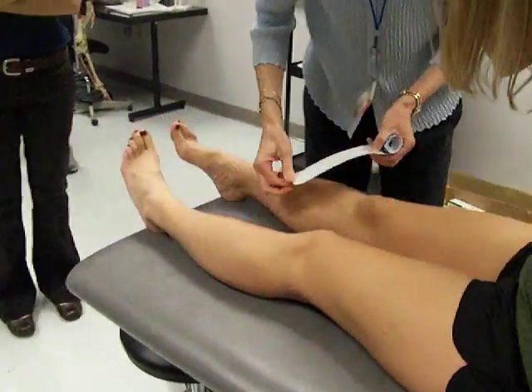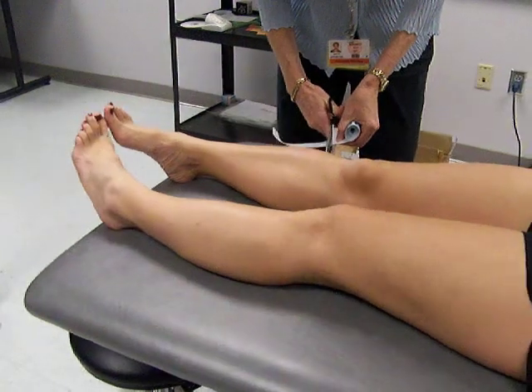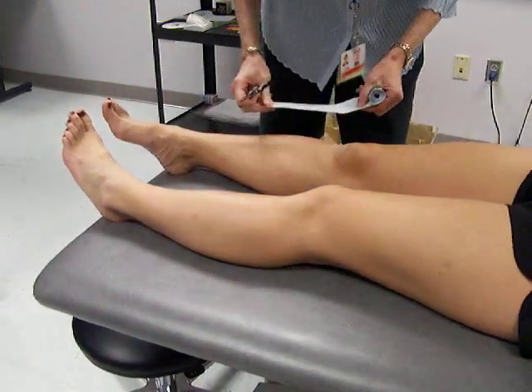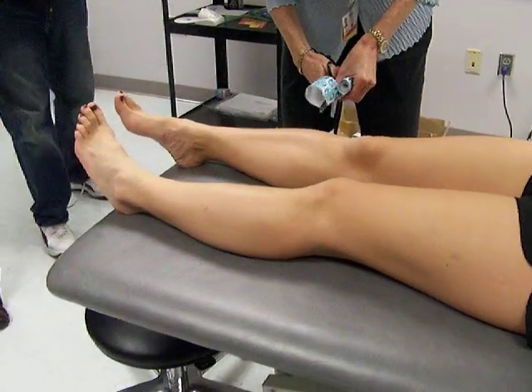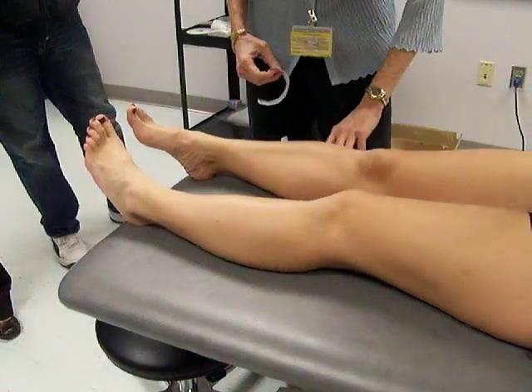Knee. Your pieces need to be a little bit longer, but not around to the back of the knee — not around to the hamstrings. Cover the patella by covering the front of the knee, but not all the way around to the back of the knee.